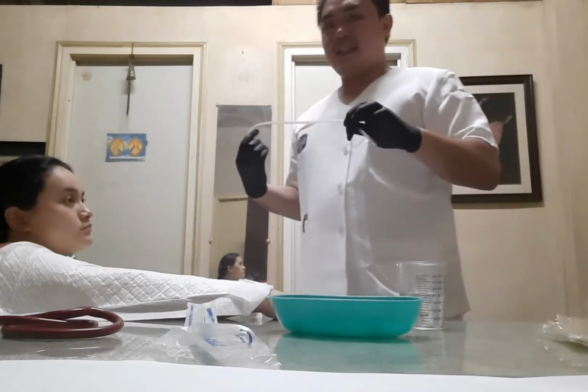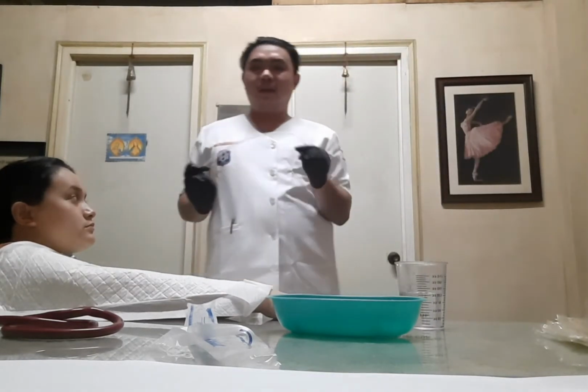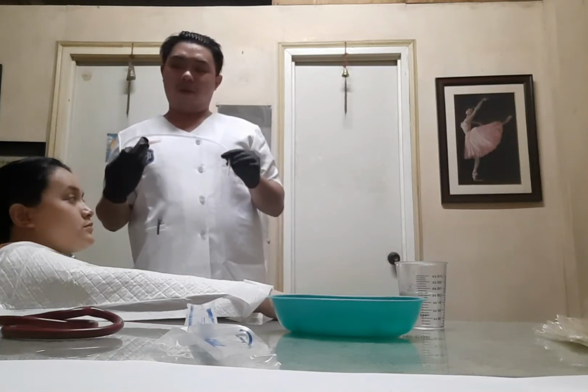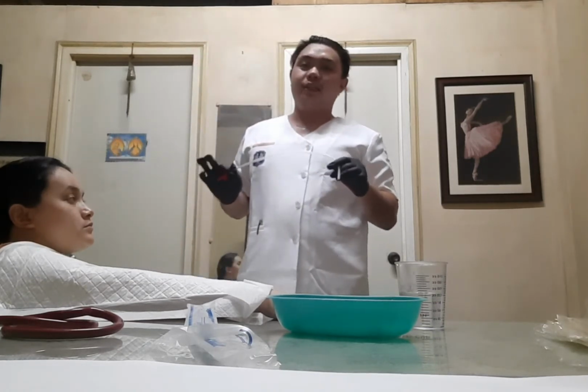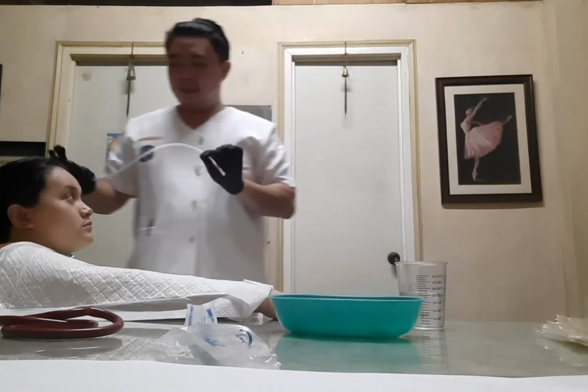Since the nearest part on the patient is the right nostril, I will be inserting the suction catheter in her right nostril. I will tilt the patient's head up.